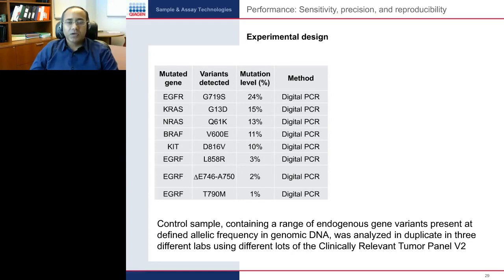This is because we have tuned our data analysis software so that you won't find any false positives. However, if you use alternative data analysis tools such as CLC Cancer Workbench, you may be able to detect these low frequency mutations also. And we have seen that if we use samples which contain mutations at a frequency of more than, let's say, 8%, we can call those variants using our gene panel.